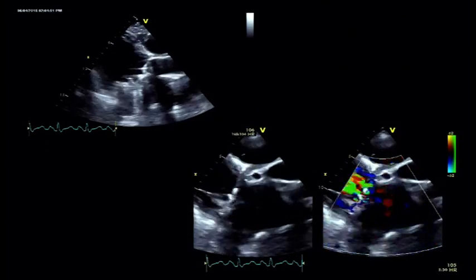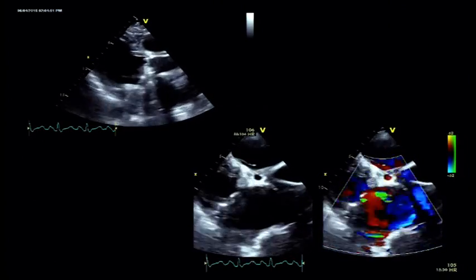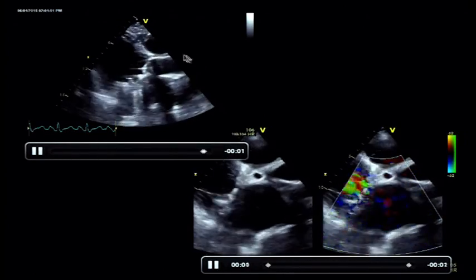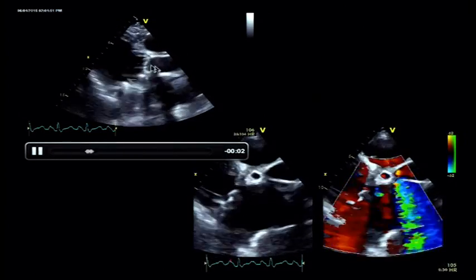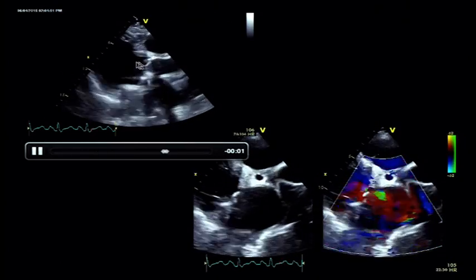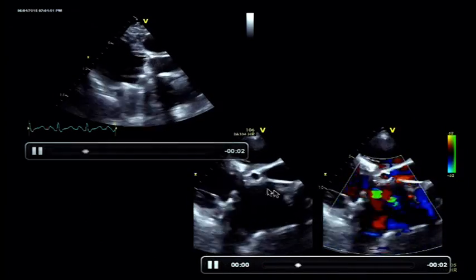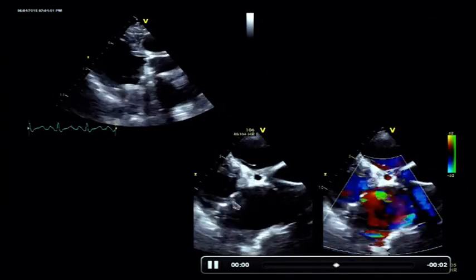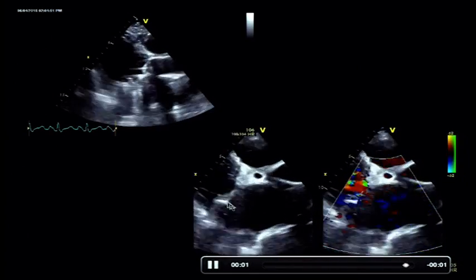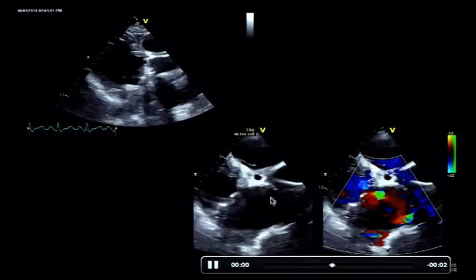Patient 4 is a little complicated, more complex. This patient had Marfan syndrome. He had a Bentall, and this is the conduit which you see here, and this was the mechanical aortic valve here, and this was okay, not an issue here at all. But the patient basically came with occlusion of one of the discs here. He also had an associated mitral valve replacement for mitral valve prolapse. And this was the one which brought him to the emergency care.